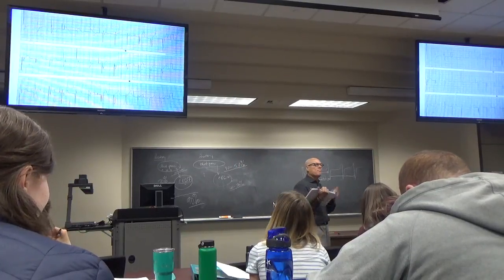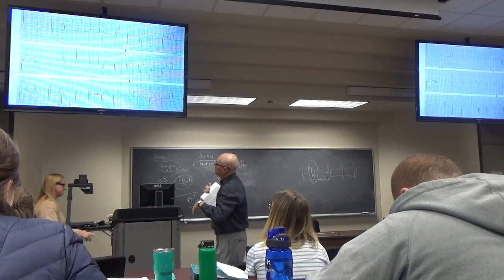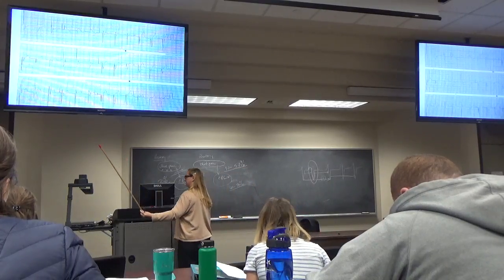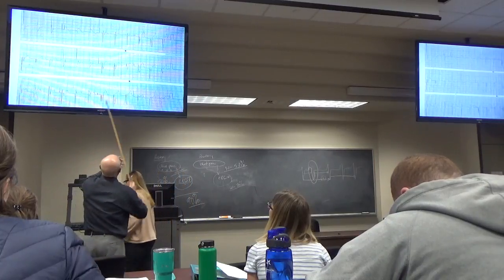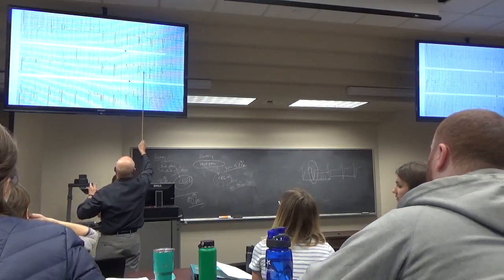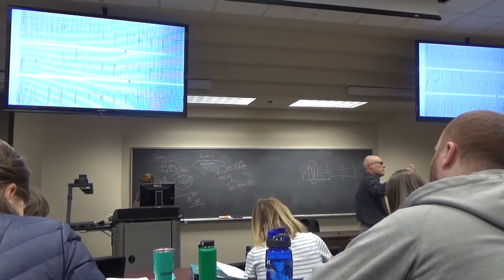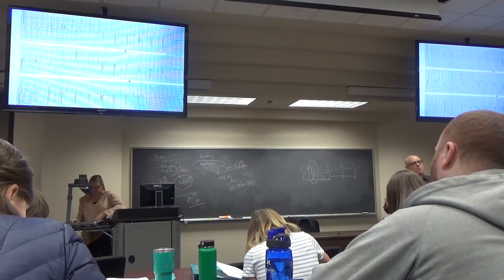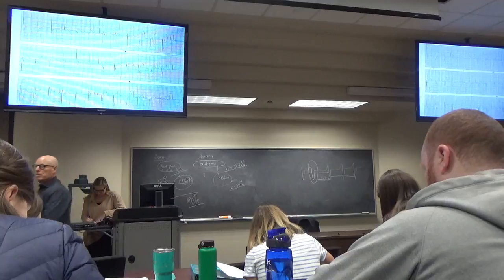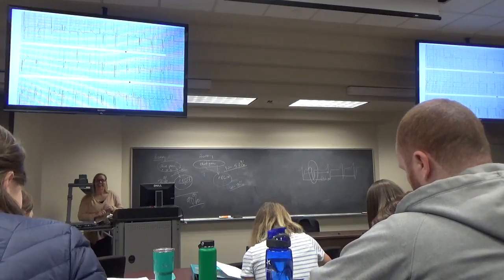Right. So this is a pacemaker rhythm, and the way you know it is that those things at the beginning of the ventricular depolarization curve are artificial. They're just straight down. They're just straight lines everywhere. Straight line QRS. Make sense? The pacemaker is a wire inside the ventricle causing the ventricle to fire. The QRSs are too wide. That's because it starts in the ventricle, not in the atrium. So this is a ventricular pacemaker. And the question, which ventricle is it in, is not answerable. Right? You can't tell.